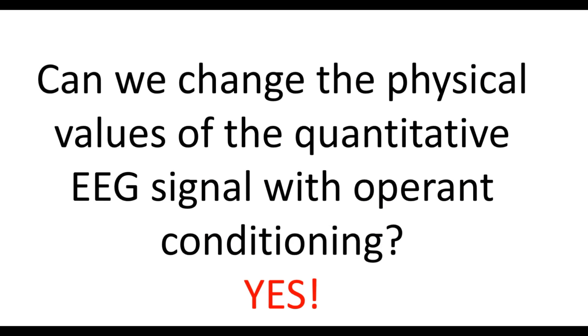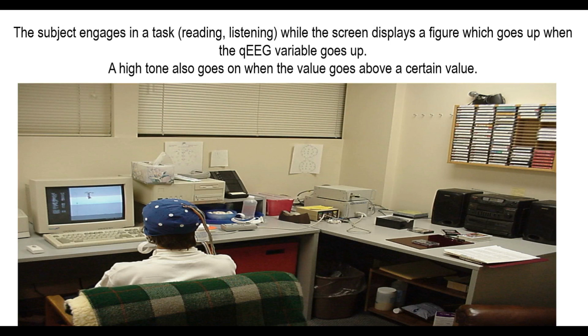Can we change the physical values of the quantitative EEG signal with operant conditioning? Operant conditioning has been around for decades, and the answer is yes. I'll show the evidence indicating that. This is a standard biofeedback session. Subject sits in front of the computer. The image on the screen reflects the value of the variable being addressed.